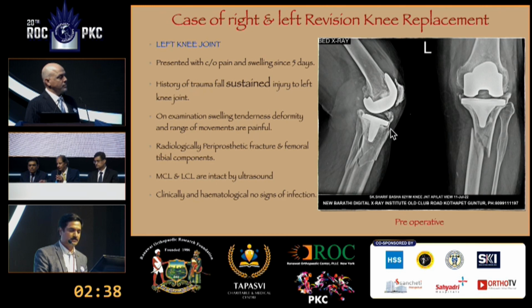There is a radiolucent line going all across the front and the back. So you put in a stacked osteotome, oscillating saw, whatever, and this should be pretty easy to remove. Remove the poly, do the femur first, and then get the tibia out.